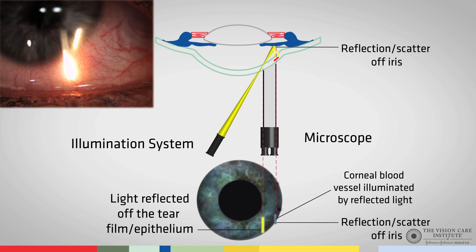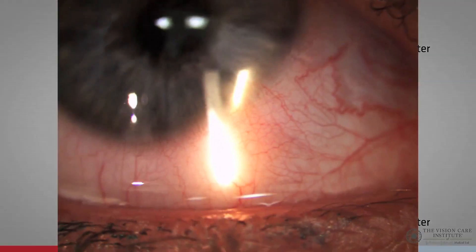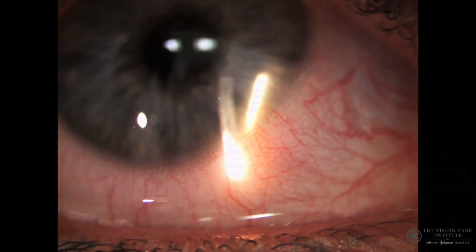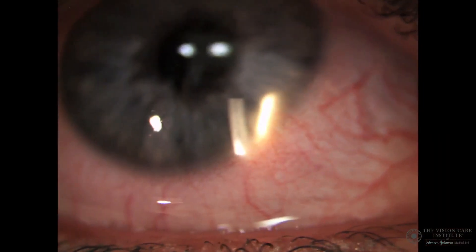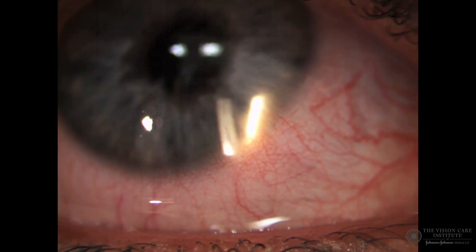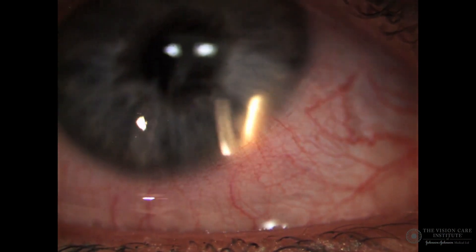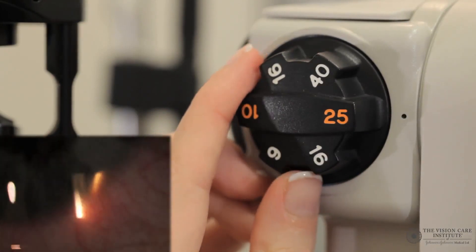Now we have seen this diagrammatically, we can start to see some of the structures here on a real eye. To improve the visibility, we can decrease the height of the slit to reduce glare. Some blood vessels are now clearly visible above the patch on the right. Increasing the magnification further allows us to see some of those blood vessels in greater detail as we can see here.